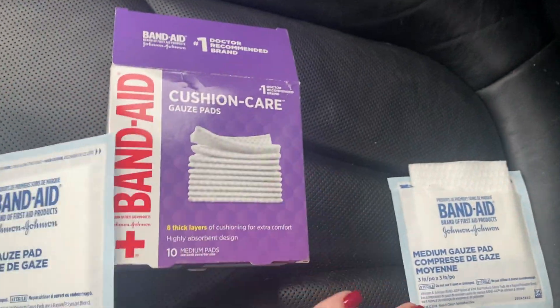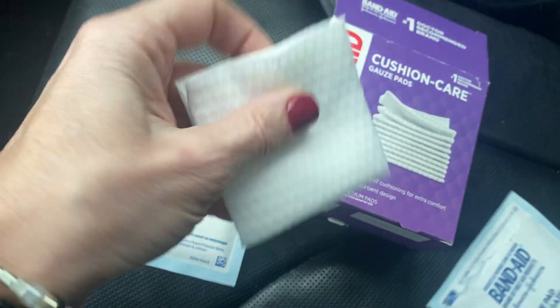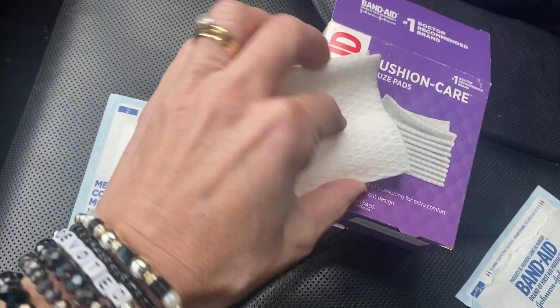Once you open it, this is what the gauze pad looks like on the inside. I've already torn it open, and it's really nice and thick — it's folded here in the middle.